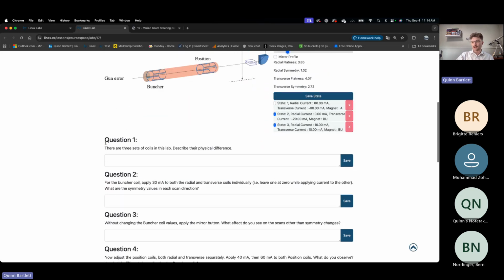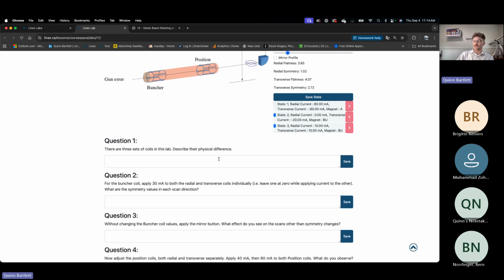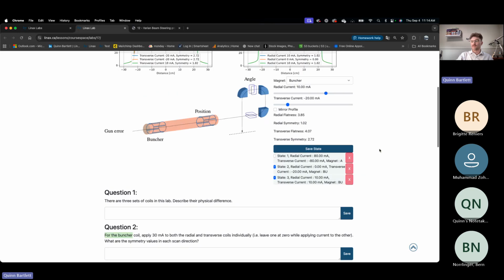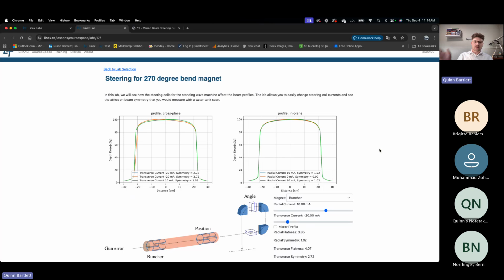So if we looked at any of these questions, there are three sets of coils in this lab. Describe their physical difference. They're just important things that I should honestly be better at and be able to answer for you off the top of my head. And then we get into things of actually applying real numbers. So for the buncher coil, apply 30 milliamps to both radial and transverse coils individually. What are the symmetry values in each scan direction? So it really just makes sure they go through all the theory and understand the important parts of beam steering or whatever topic we're talking about. So yeah, it starts there.